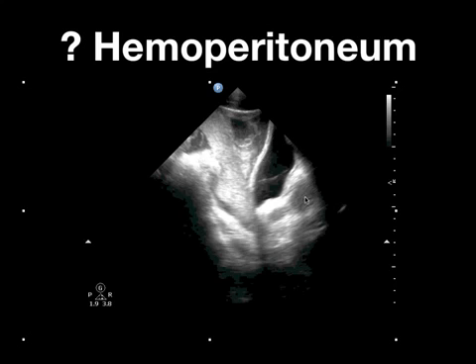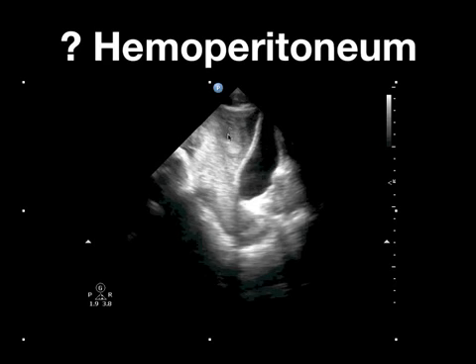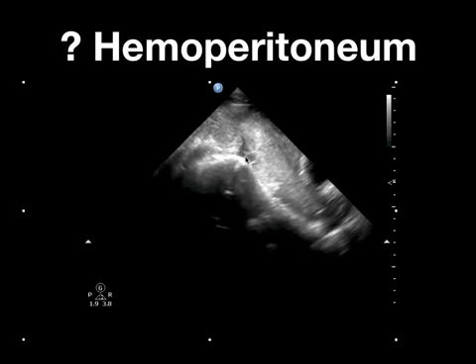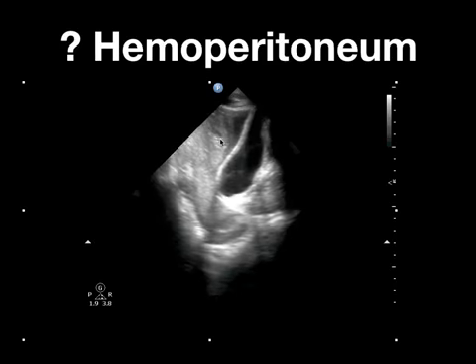You can see here is the prostate. Here are the seminal vesicles. So this here is the peritoneal cavity. You're really not seeing any bowel right there, but what you're seeing is a lot of echogenic fluid. There are some anechoic areas mixed in there, and you can see that there's nice sharp triangular corners.